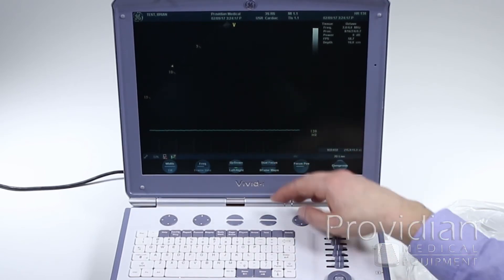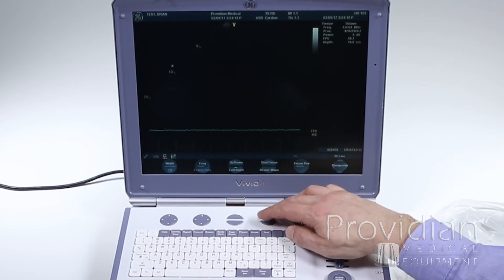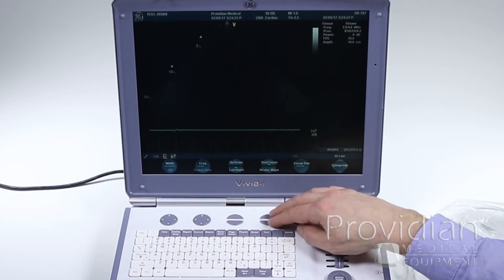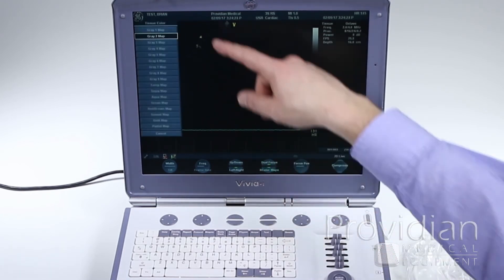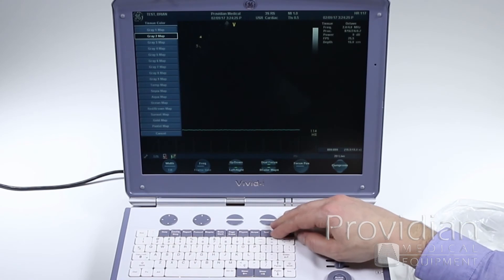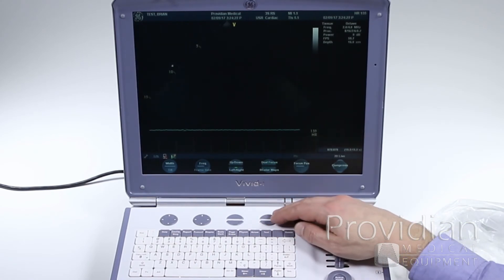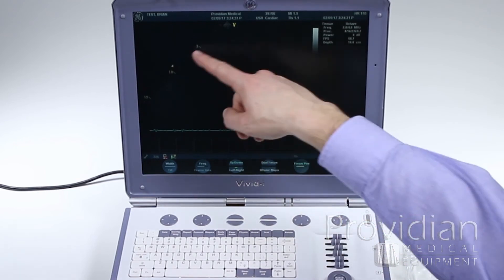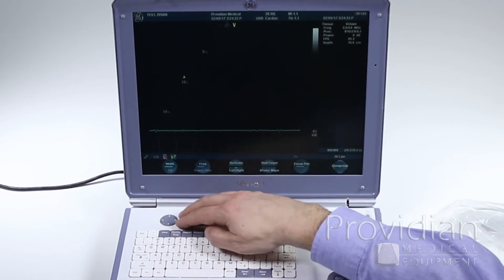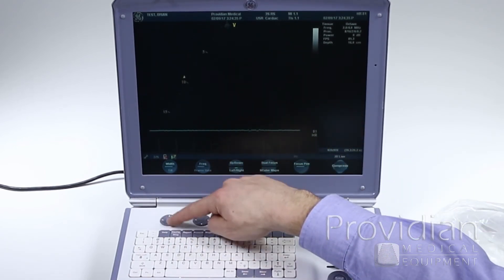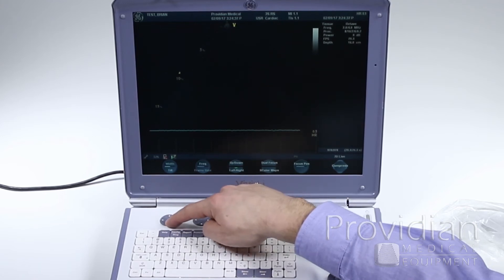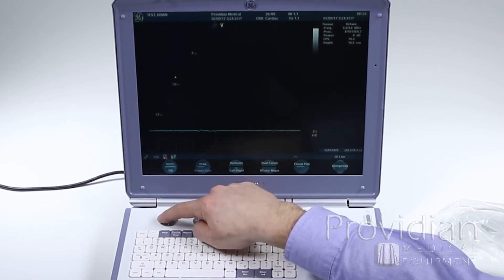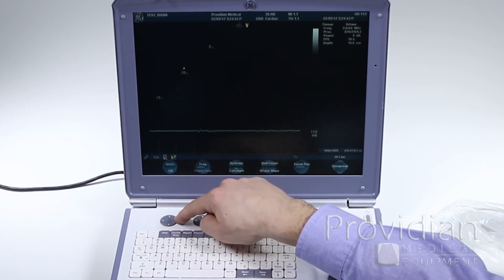We also have focal zones here. We can click up here and let's say dual focus, so I have two focal zones. I can also change my gray maps and color maps right there. Turn that off, turn off the dual focus. And my focal position, which I can move up and down, as you can see right here. So I'm going to get that width. Also, see how it says tilt down there? If I push tilt and then move back and forth, it will tilt that sector.